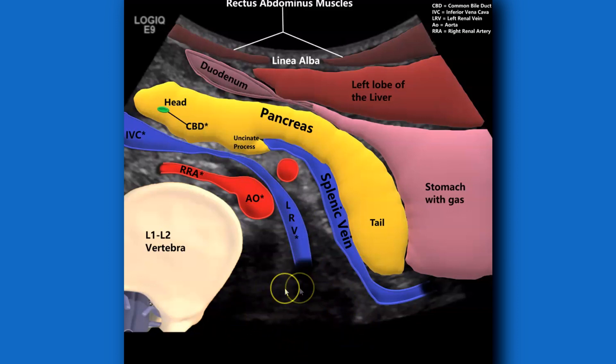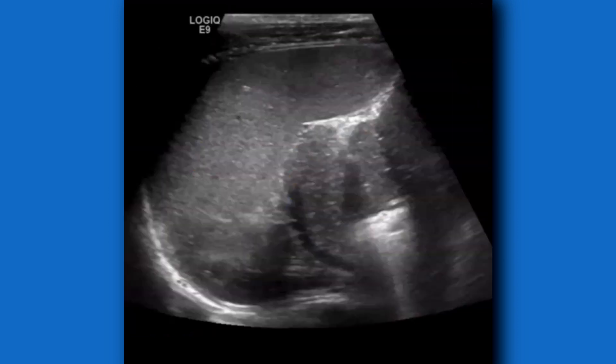The pancreas, the splenic vein going out to the spleen, IVC with the left renal vein, left kidney probably around here, aorta, right renal artery — always good to know the right renal artery goes posterior to the IVC in normal cases — and then the vertebrae.